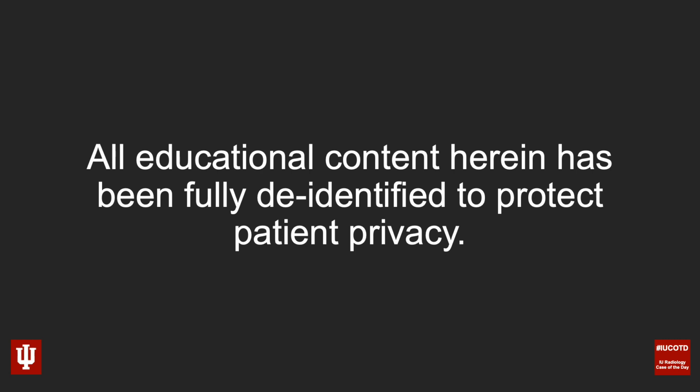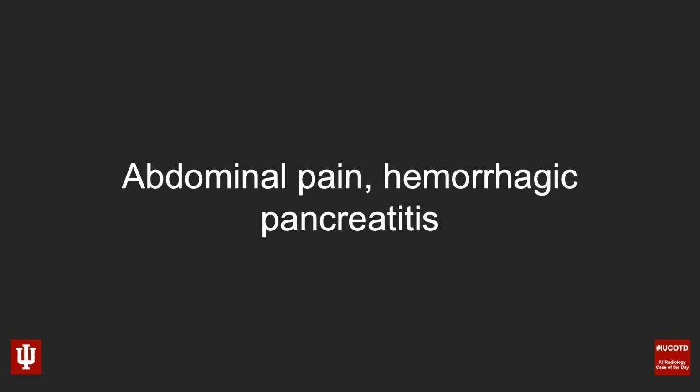All educational content has been fully de-identified to protect patient privacy. For history on this case, we have a patient experiencing abdominal pain and hemorrhagic pancreatitis.